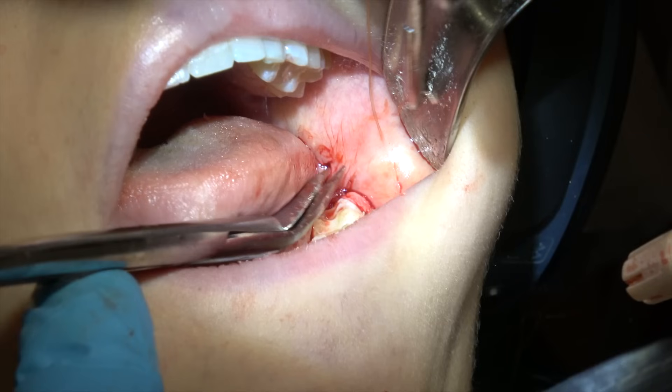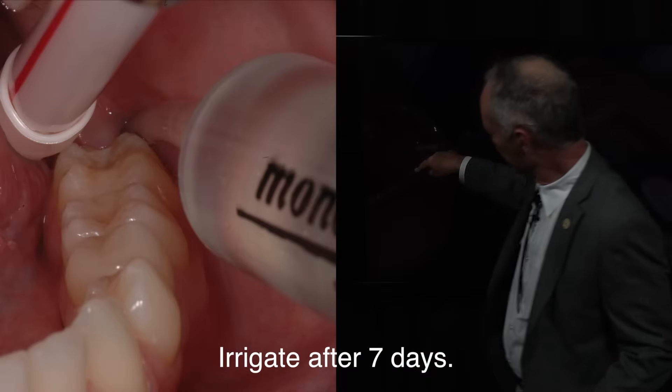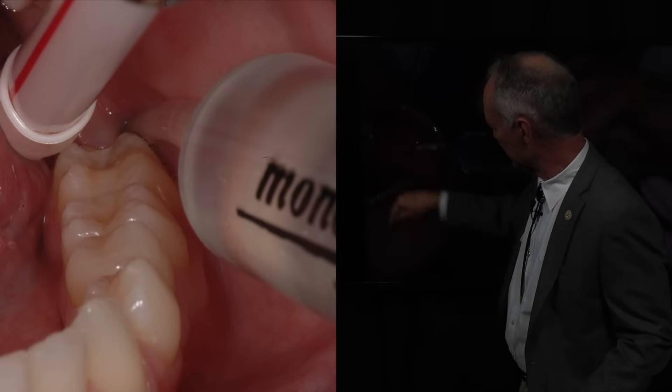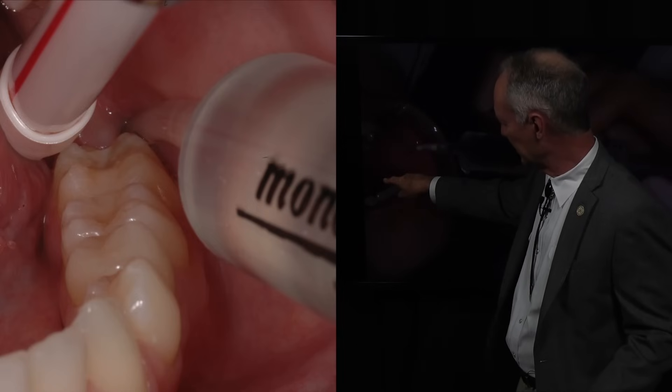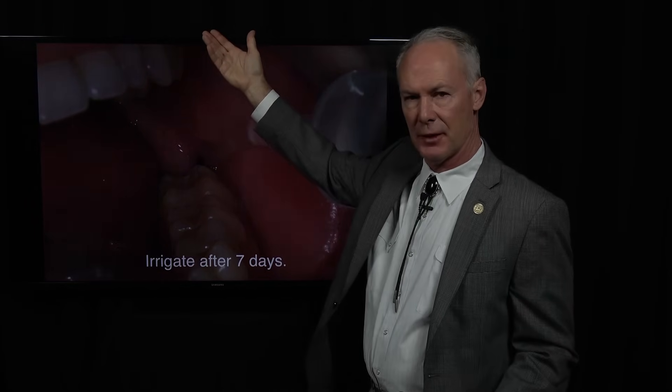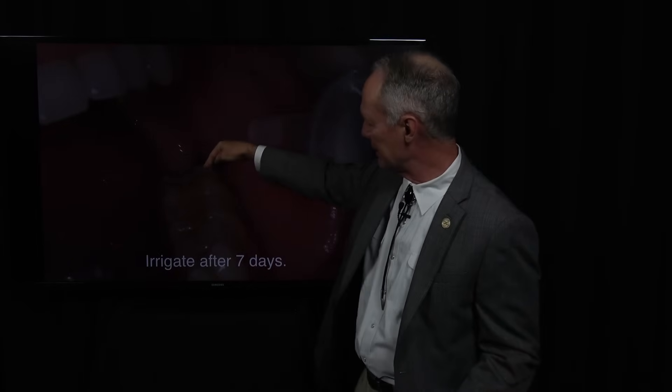Now when the patient returns in 7 days, we're going to rinse the socket with a Monoject syringe with half mouthwash and half lukewarm water. I tell the patient, take the tip of the syringe right down the center of the teeth in front of the extraction site. There'll be a hole behind the second molar and just place that tip in the hole. When they're using the Monoject syringe, they don't press hard. What they're doing is irrigating anything in the socket up to the surface. There'll almost always be a small hole there into which they can place that tip.